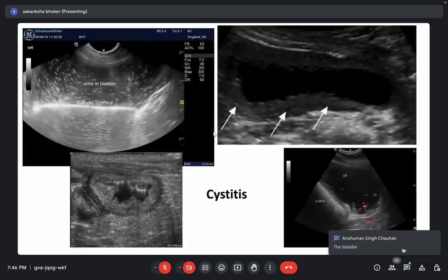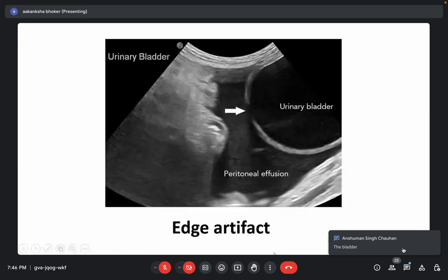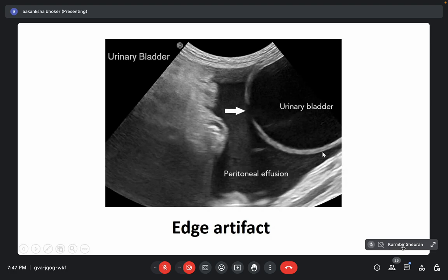Now we should assess the thickness of the bladder. Thickness we can generally measure at the far wall, or the dorsal wall of the urinary bladder, because at times these far echoes are better resolved in comparison to the near echoes. The thickness will vary depending upon the level of distension.